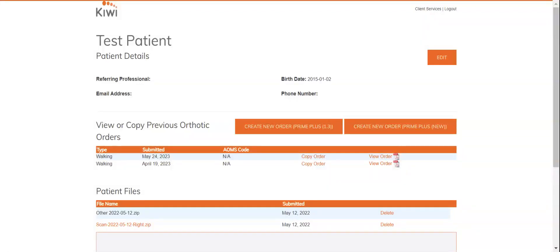Welcome to the Kiwi Orthotic Services ordering walkthrough for the standard view. Today we'll be looking at placing a simple order right from your account just for a fake patient.